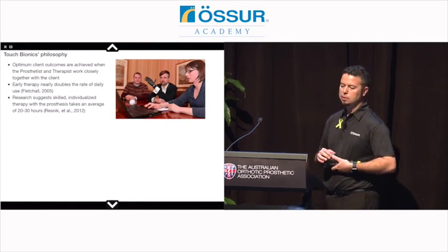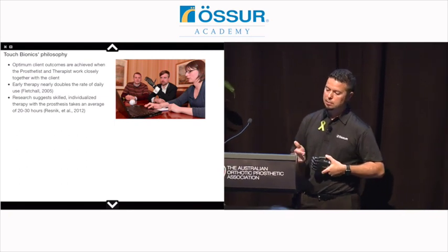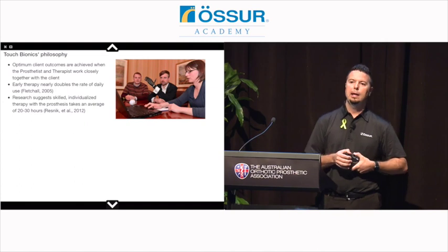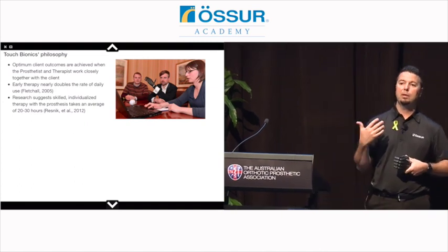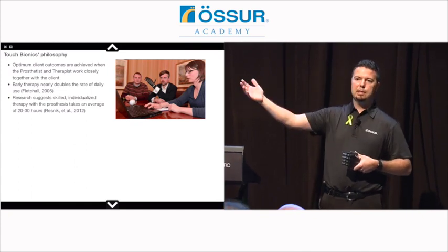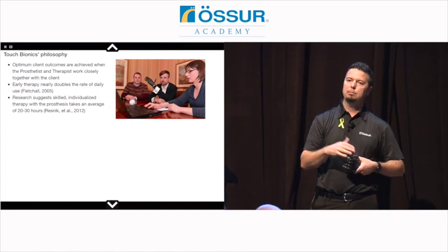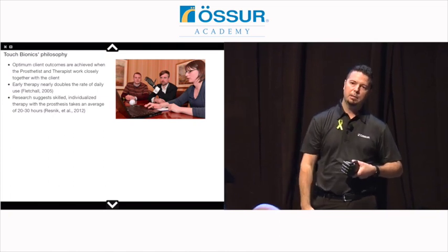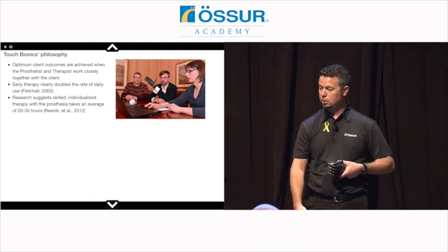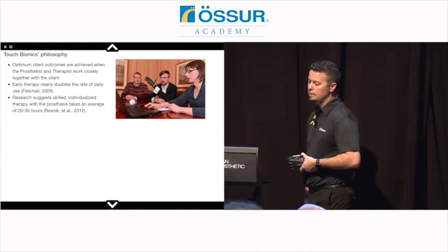Some research to support the use of a therapist working with one of these devices. Early therapy nearly doubles the rate of daily use. So you think about upper limb devices and the ability to go without it, right? We're symmetrical. We could be cut in half and still use half of the body, right? And now you provide a prosthesis that a user may or may not accept. Whereas with lower limb, even if the leg doesn't fit well, if I want to walk or ambulate, I'm going to continue to use it, try to use it, get it adjusted, right? With upper limb, not the case.